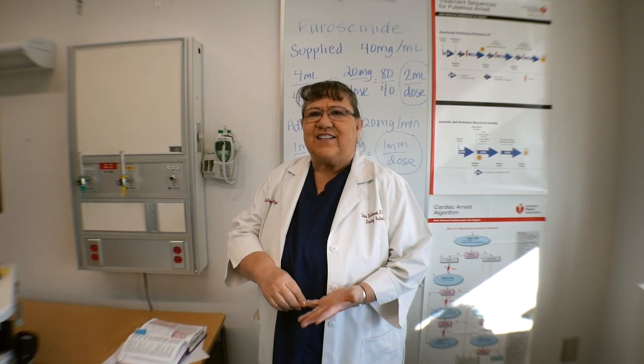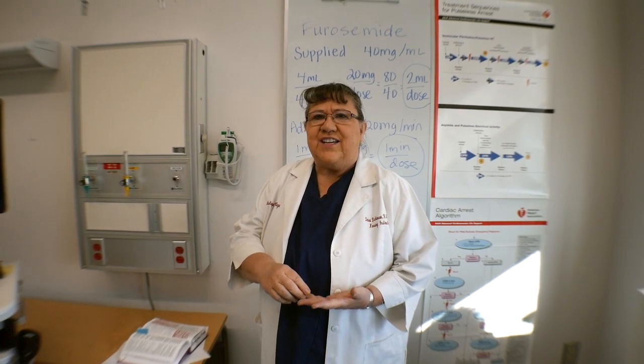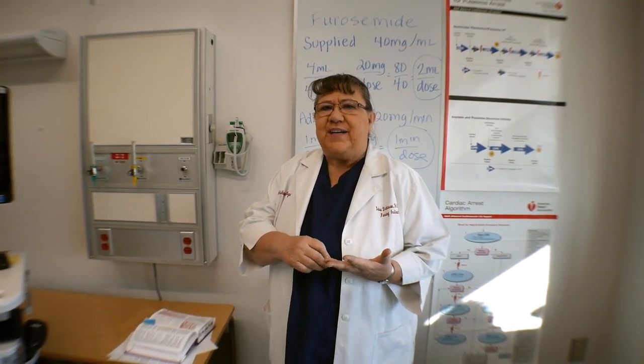So you'll be getting the information that will list 6 different scenarios, and they're going to be all IV push. So you need to look at the different medications that are listed. You could be tested on any of them. So one of them is going to be through the saline lock directly, and the other one will be through the tubing. And I'll demonstrate both of those.